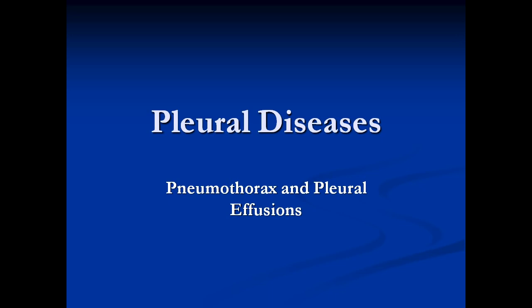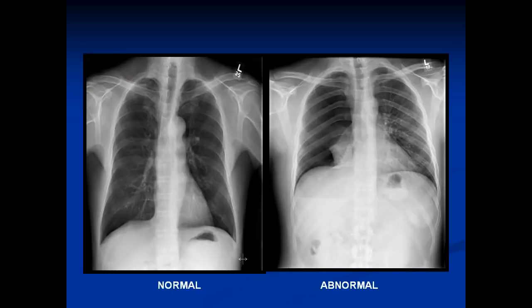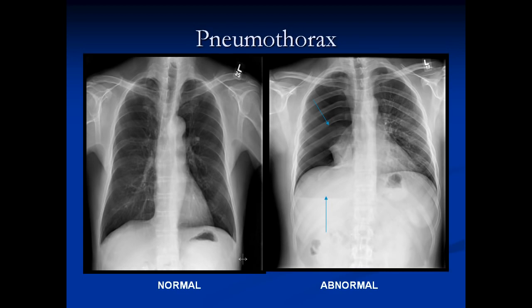Now we're going to talk about pleural disease — pneumothorax and pleural effusions. This is the same patient: a normal chest on this patient, and this is after a pneumothorax. There are two features you should see. The first is that the whole lung on the abnormal side is collapsed — this is all air, and the white stuff in the middle is the lung. We've got an air fluid level at the base. Any time you get a pneumothorax with a little fluid, you're going to get an air fluid level — it implies there's air and fluid; nothing else can cause a level. The left lung is unremarkable, and there's no mediastinal shift, so this is just a straightforward pneumothorax.